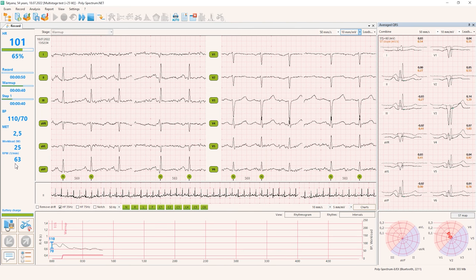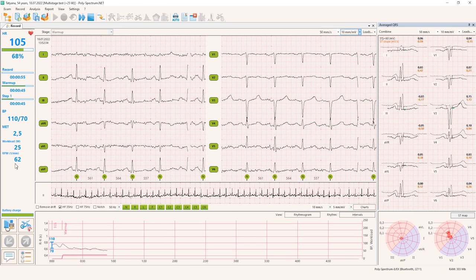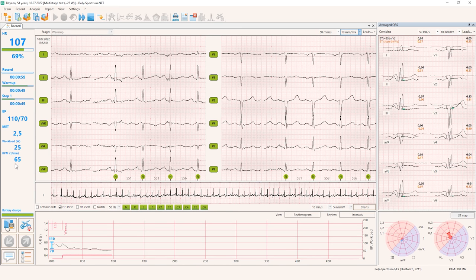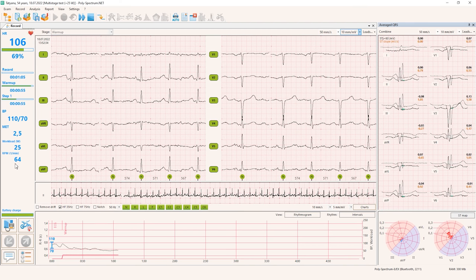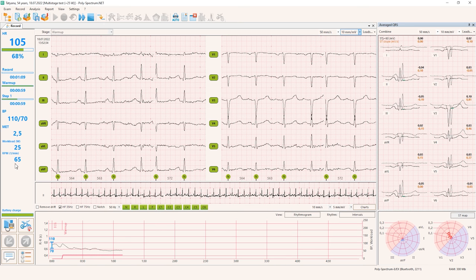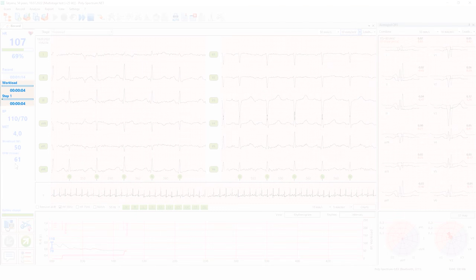You can actually skip the warm-up phase if your patient is aware of the test or the procedure, or is riding a bicycle every day, so no problem. But if your patient is not familiar with the procedure, you should better have this warm-up phase to get the patient used to this setting and also to check if everything is okay. Then the software starts the exercise protocol itself.